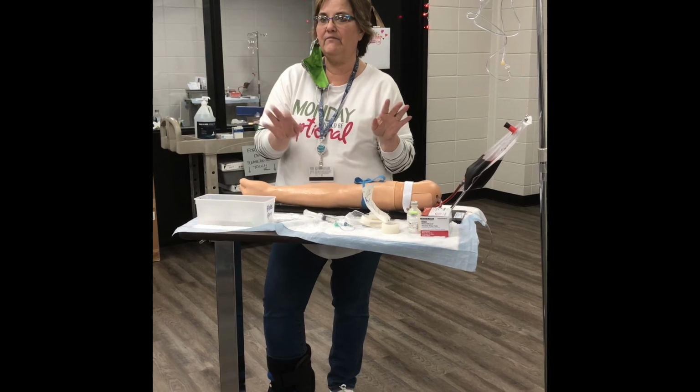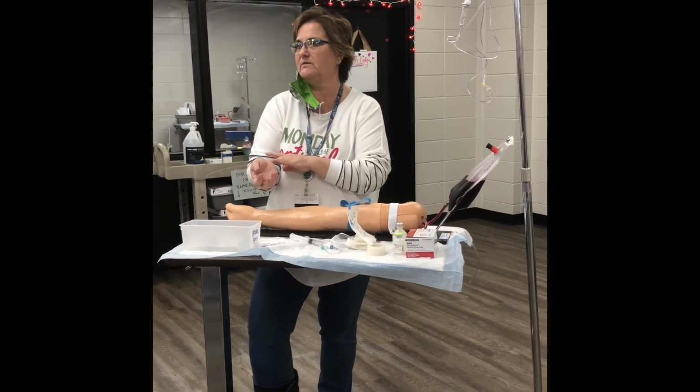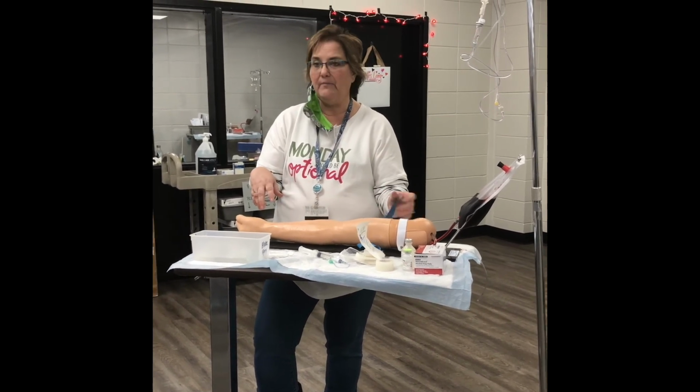We're going to pick our vein by choice. So in a real person, you're just going to pick whichever one feels the fullest, the spongiest. Once you've picked it, you can pop that while you clean it.